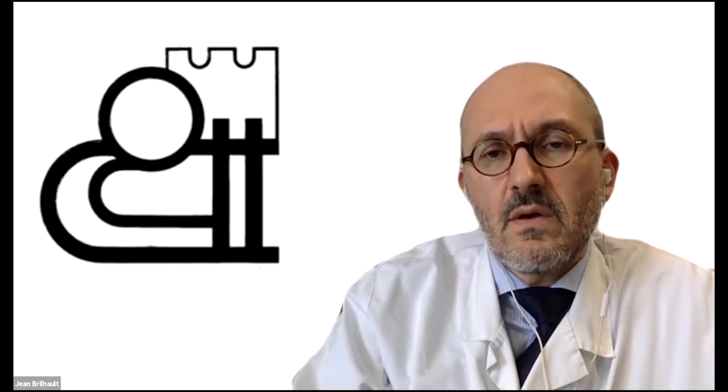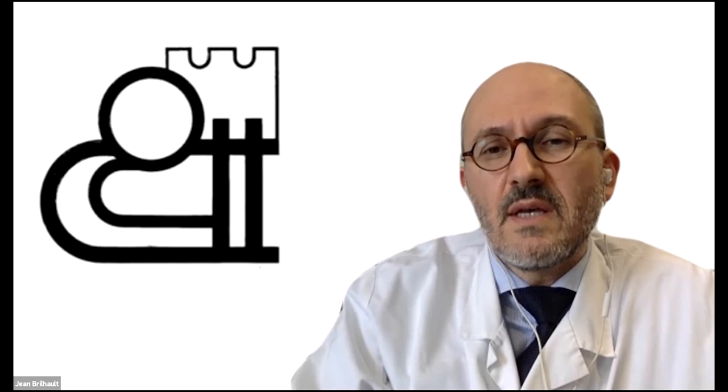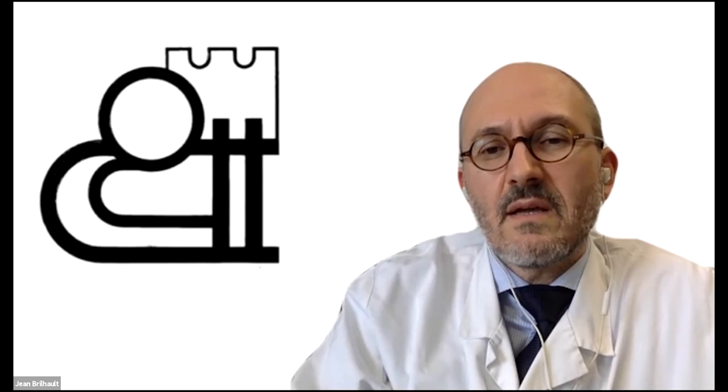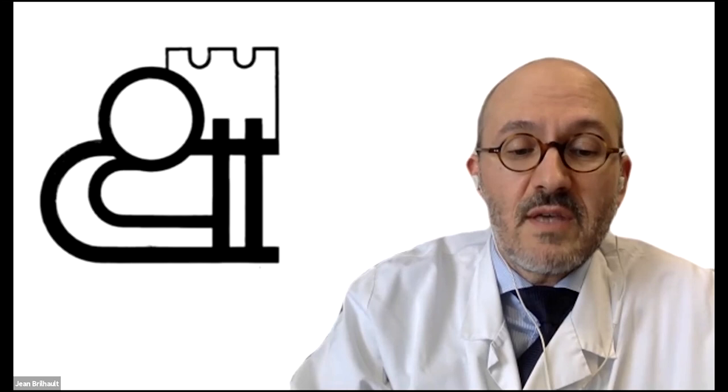And regarding the surgical strategy, level of cuts, orientation, I try to do it as I would have done it initially if this ankle hadn't been fused or attempted to. But this is another presentation. That's why I want to keep it as anatomical as possible. Probably for another session.